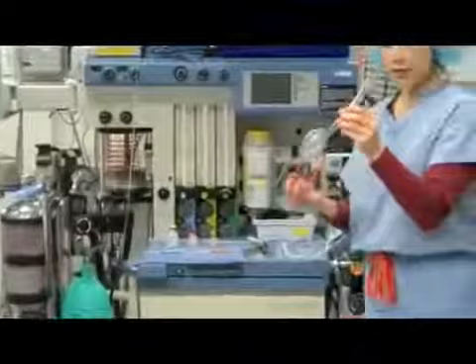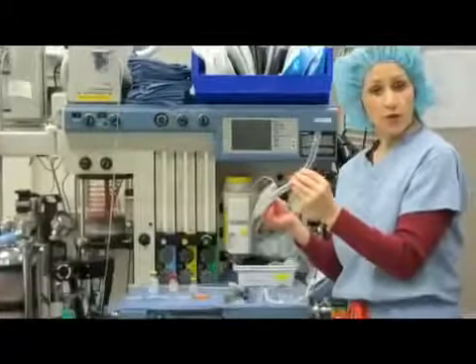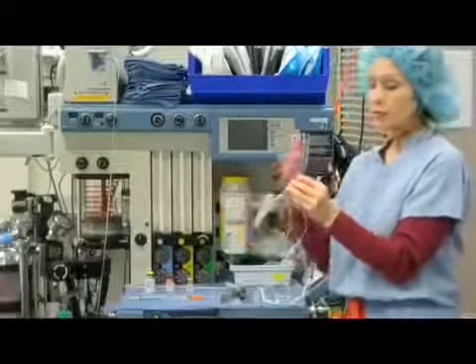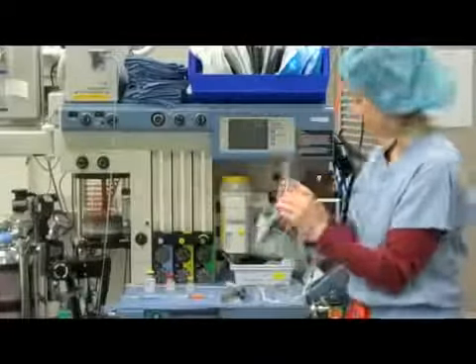This is called a laryngeal mask airway, or LMA. It is placed in the mouth, down and above, and it sits right above the vocal cords, and it allows the patient to breathe gas easily in and out through this device.